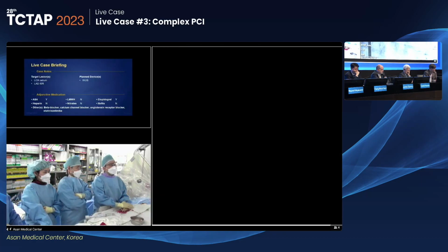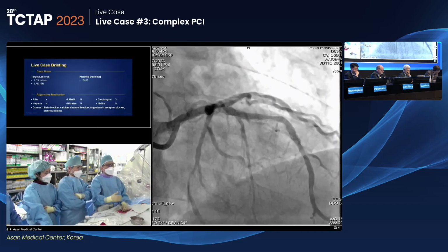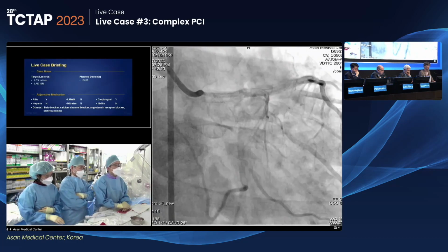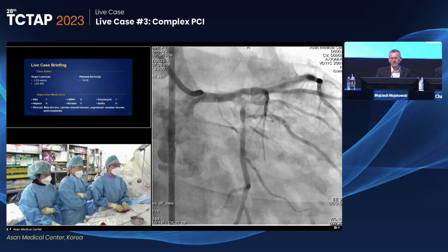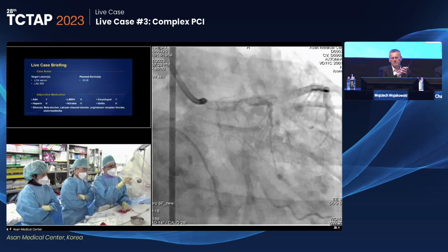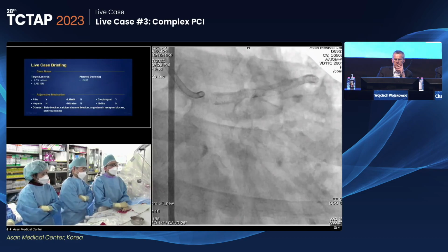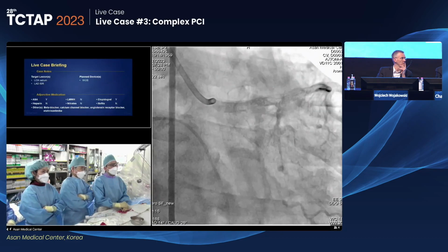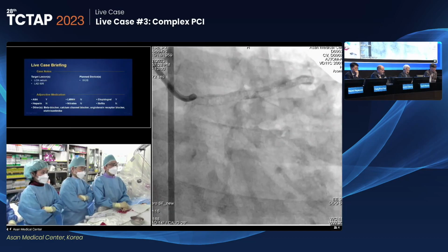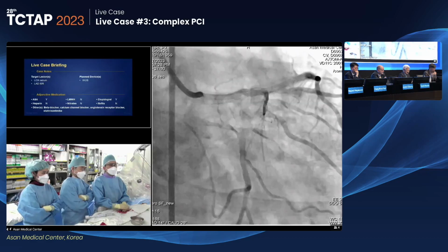Next. There's also a lot of calcium, especially at the lateral aspect of the stent in the left main. So do you think it can be secondary stent collapse due to the calcium burden from outside? Oh, yes, that's a very good point. I think that outside of the stent, the calcium grows, and that would make the burden at the circumflex ostium. I agree with the opinion. I think you may be right. The stent angiographically looks a little narrow at that point. Either it didn't expand fully or it got compressed. Yeah, it can happen during the 4 years of calcium growth.